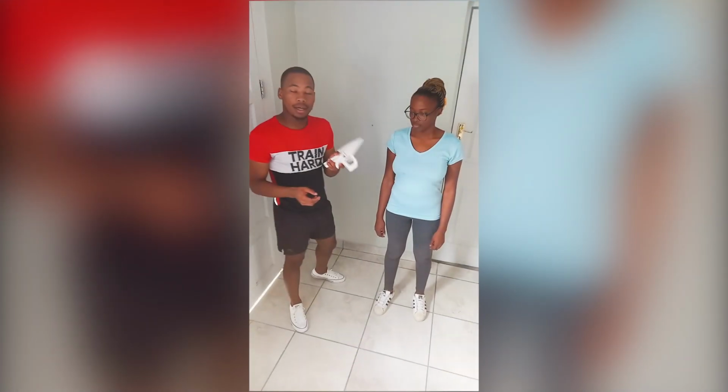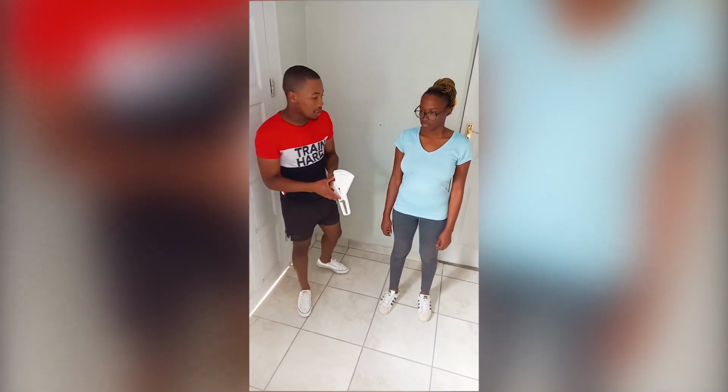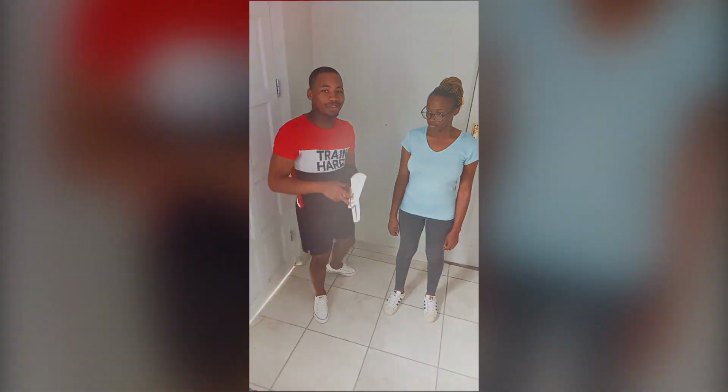Now we will take a body fat measurement using this skin fold equipment. We will take the measurement, then I will show the calculation at the end just to save time. Thank you.